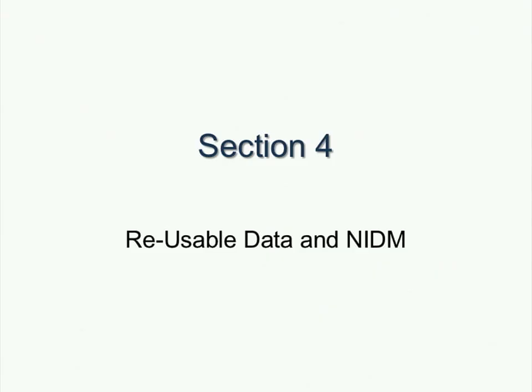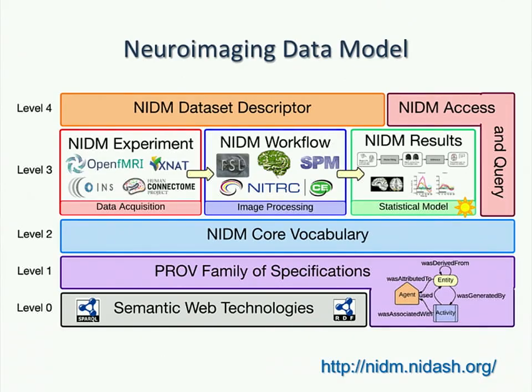And then the last section talks about the neuroimaging data model. So we talked about BIDS. And what NIDM lays on top of BIDS is additional information about the experiment, about the results. And so again, when we talk about mapping data, so you want to map information about the subjects, what they did in an experiment, how they relate to their files, that in itself is also a graph, right? And so what NIDM does is represent these experiments as graphs, so tools can be built on top of that to search across the data within your own local file system, for example.